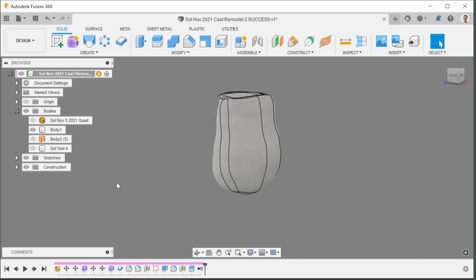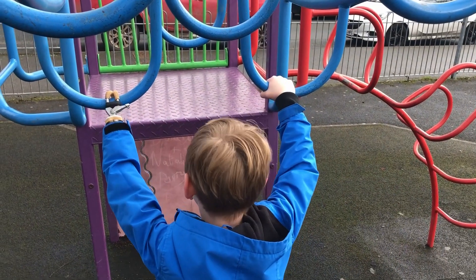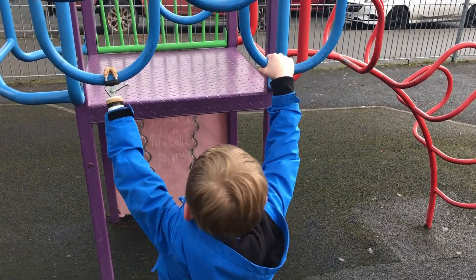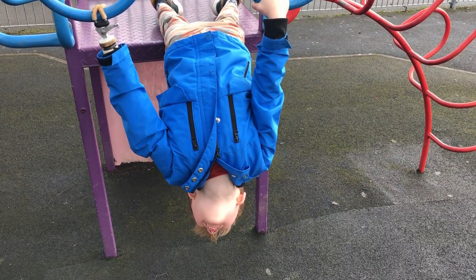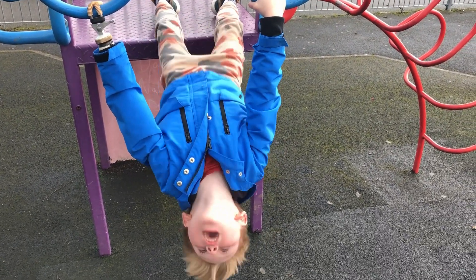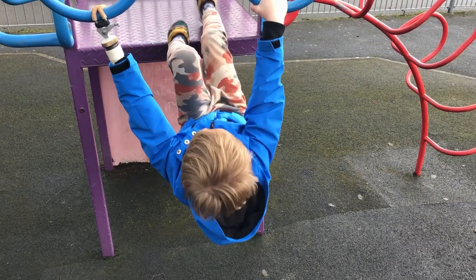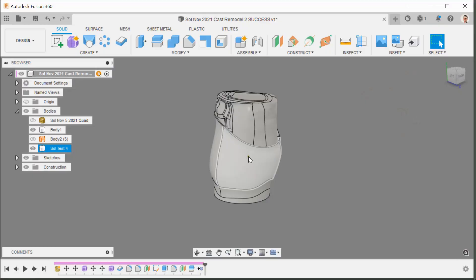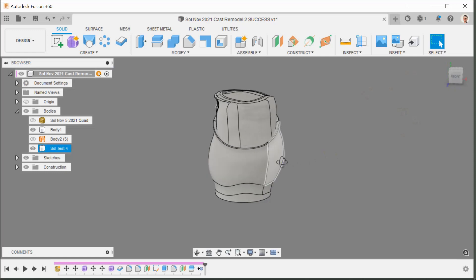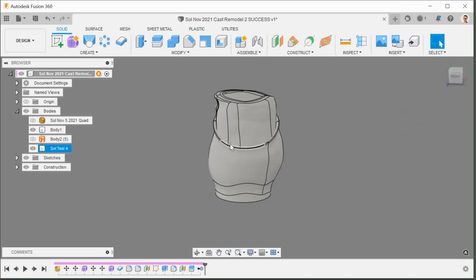I modeled the socket in November and Sol's been wearing it every day — doing sports, climbing, all sorts of things — so he's put it through its paces. There haven't been really any issues aside from a red patch that keeps emerging, so on the previous socket the relief cut on the trim line here was 8 millimeters higher.